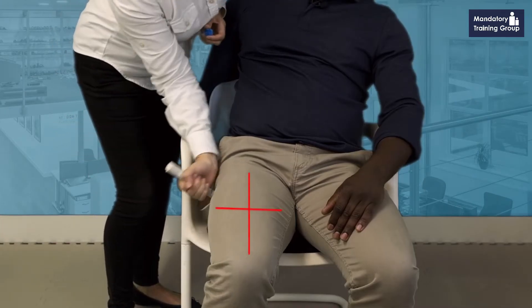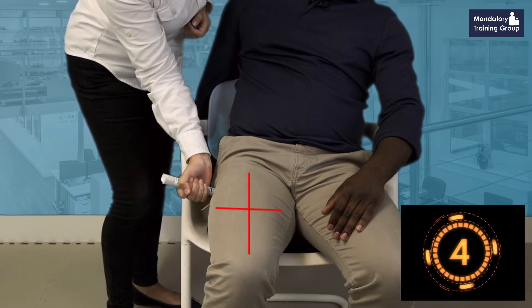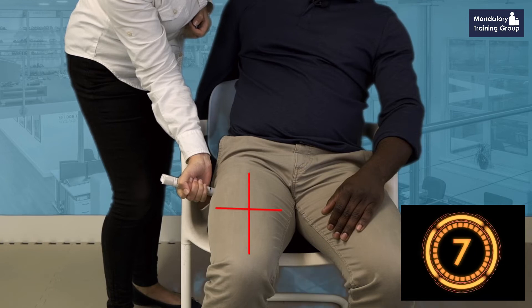Hold your hand around like that and then stab it in and hold it for one, two, three, four, five, six, seven, eight, nine, ten seconds.